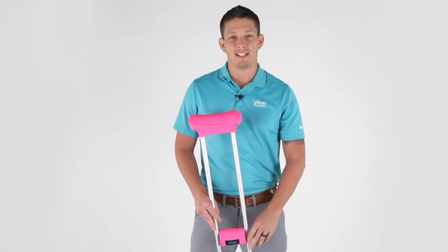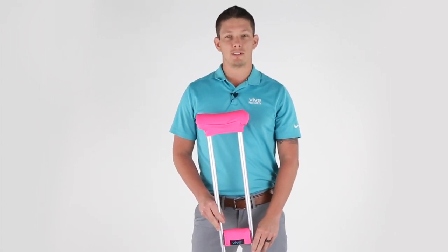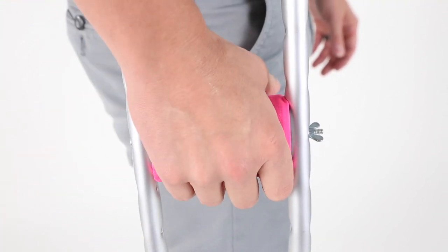Hey there, Brandon from VIVE Health again. Today we're going to go over our crutch pad. Our easy to install contour crutch pad is made with extra soft padding that eliminates chafing and irritation while protecting your clothes.